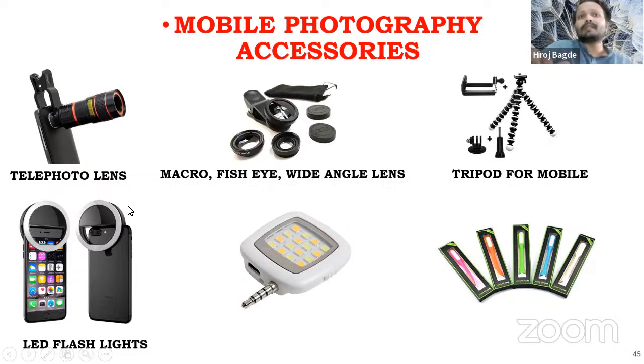I'm telling you, there are buttons inside this. We can manipulate the power: power 0, power 1, power 2, power 3, power 4. We can go to the max power. So this is the same power system which we talked about when practicing twin flash photography. Yesterday I showed you 2 images. So we can definitely change the LED flash system, the light system.